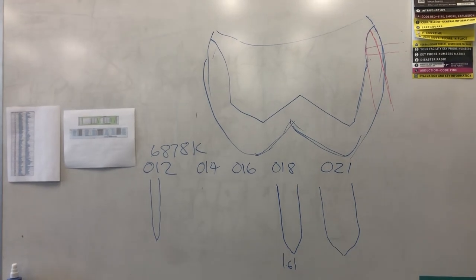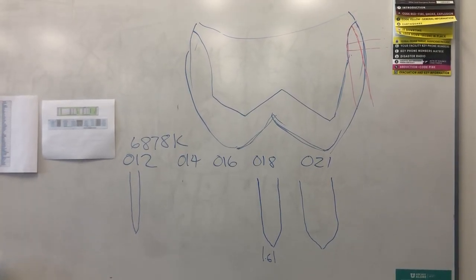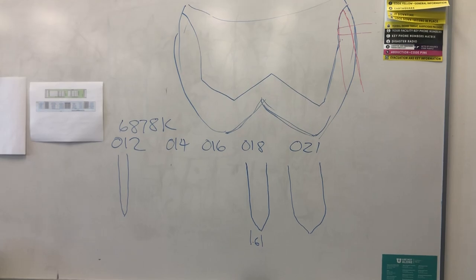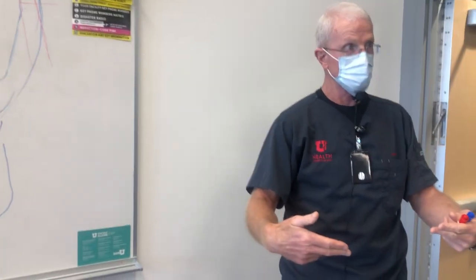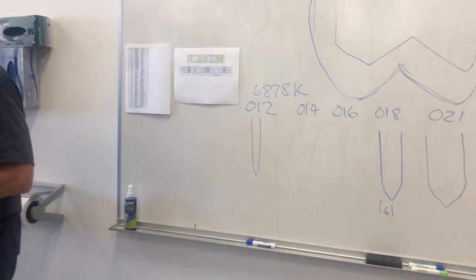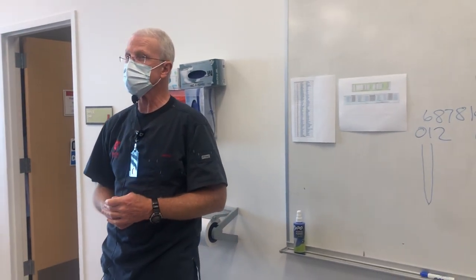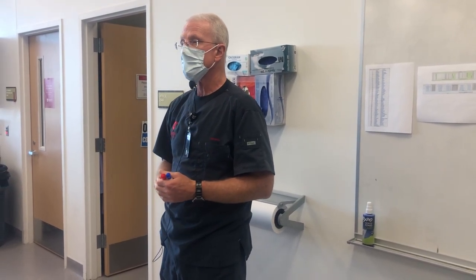So why do we even have a chamfer diamond? Why do we do chamfer preparations rather than rounded shoulder for everything? Any thoughts? That's one reason right there. You're absolutely spot on. A shoulder margin is deeper in the cervical region of the tooth, and it's more aggressive. So good point. But I'll tell you what, if there's a lack of tooth structure, you're not able to put a whole shoulder on. So the chamfer is a little easier that way, isn't it? You're absolutely right. I'll tell you the main reason we do it is they're easier. They're just a little easier. They're more user-friendly for most of us to do a chamfer preparation.